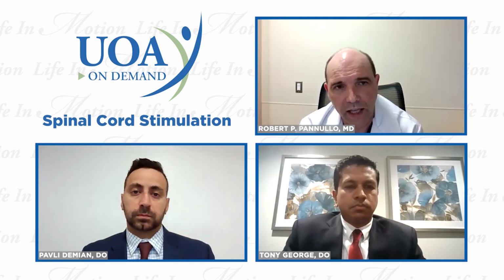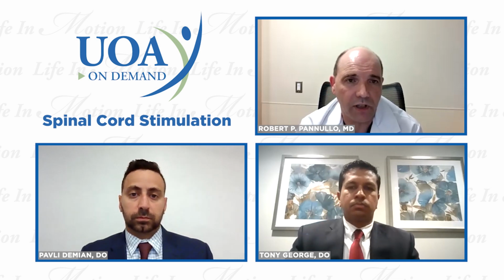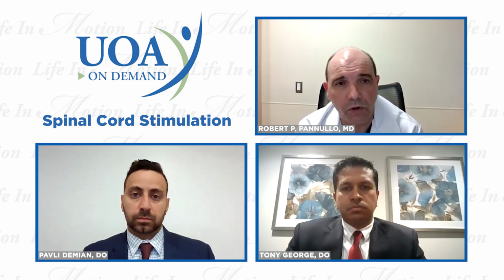And then typically over that following week, the patient is followed on a daily basis by the spinal cord stimulator representative. Different settings of the unit can be tried to optimize the therapeutic effect of the stimulation. And then within a week, and I usually do not like to do more than 1 week, have that lead taken out, and then reassess to see how much improvement was seen. And then from there, have the patient be considered for the formal or the permanent implant.